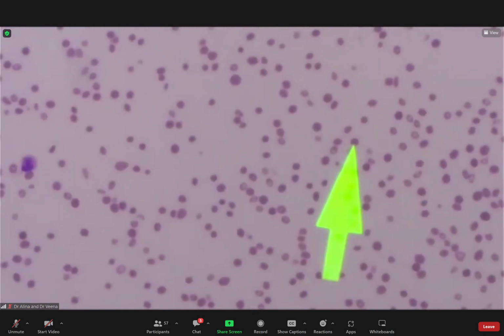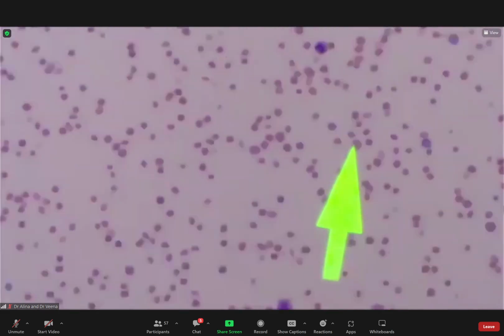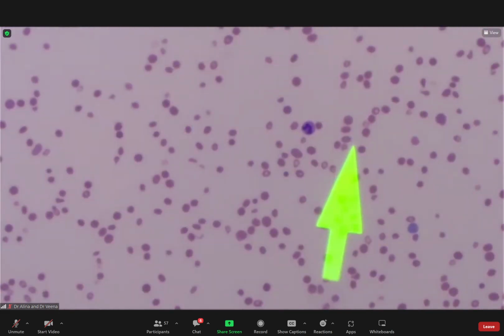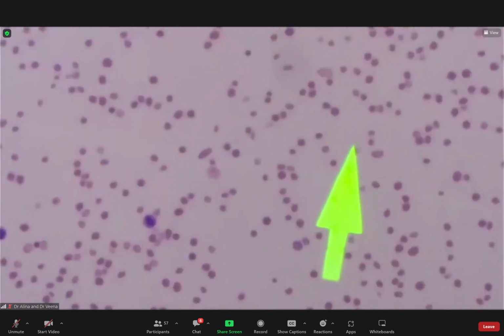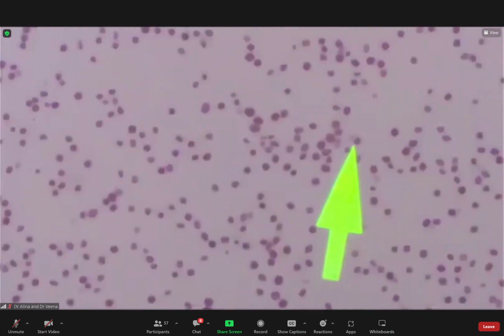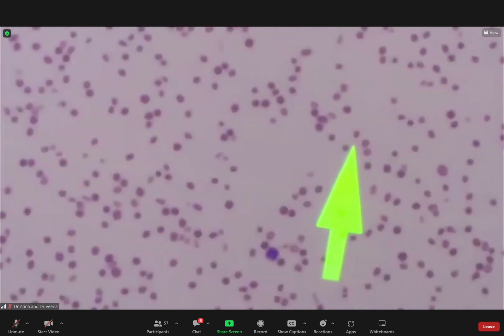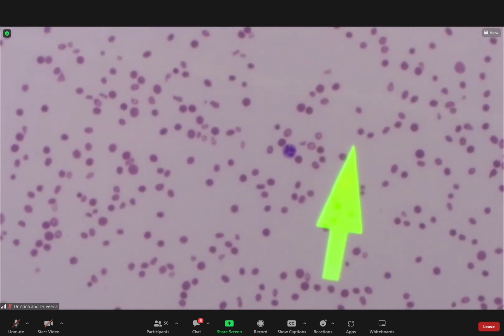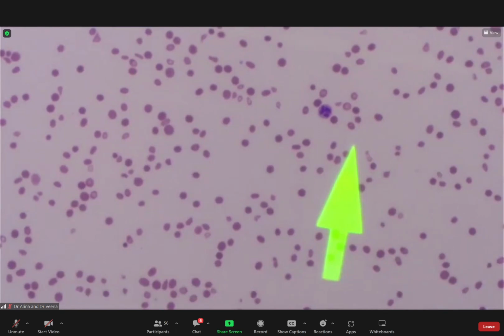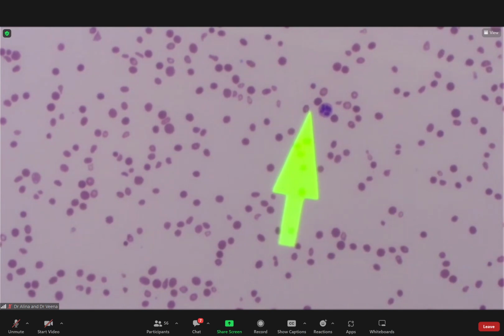Oval macrocytes, pancytopenia. And if we're lucky, this is... no, it's not. And this one also is an exam question. Definitely can come. Okay, there. What is that? What is that neutrophil? Hypersegmented neutrophil. Okay. So this was the clincher actually.